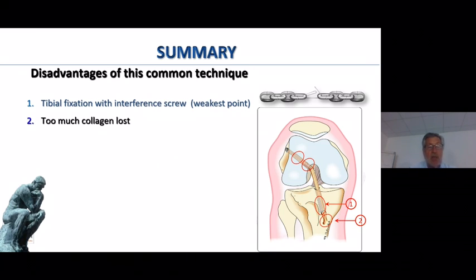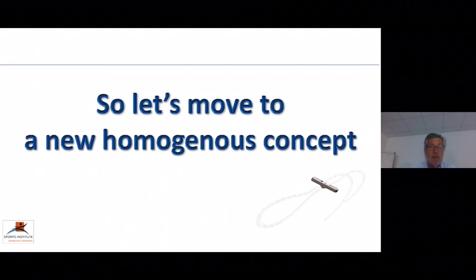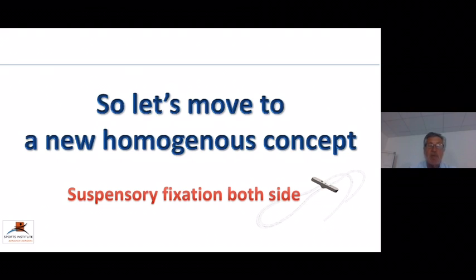Second, we lose too much collagen, and we will see this later. We harvest two tendons, which could lead to a knee flexor deficit, too much bone removed on the femur, and no control of the graft length inside the tunnel. So let's move to a new homogeneous concept, the suspensory fixation on both sides.